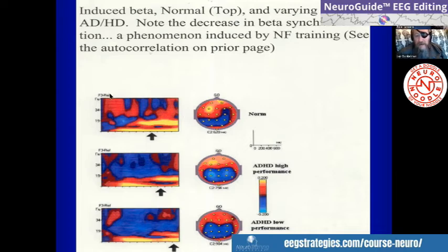And this is, again, brief bursts of theta, brief bursts of gamma. Persistent gamma is pathology. Chirps of gamma is normal. You can see pathological gamma in thalamocortical dysrhythmias with pain, movement disorders like Parkinsonism, tinnitus, focal epilepsy, some forms of reward deficiency, some eating disorders, obsessive compulsive, depression, those kinds of things. So there's gamma that can be pathological as well.